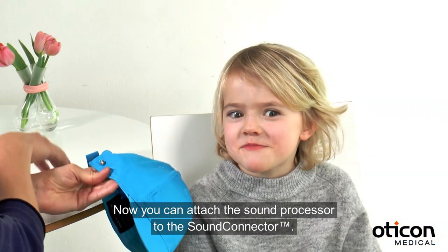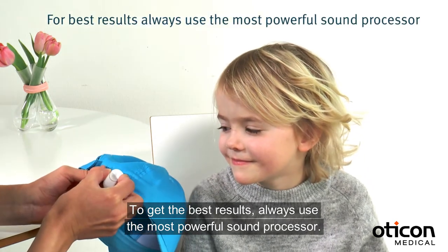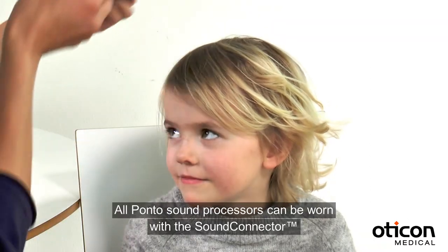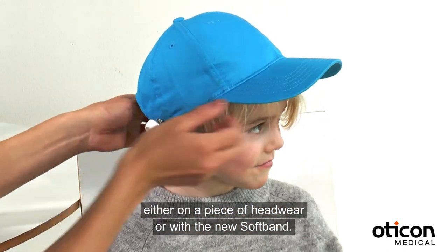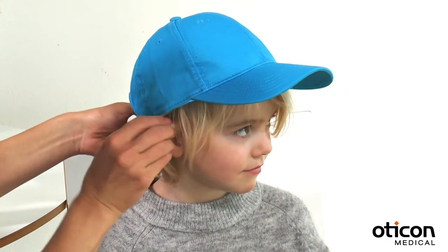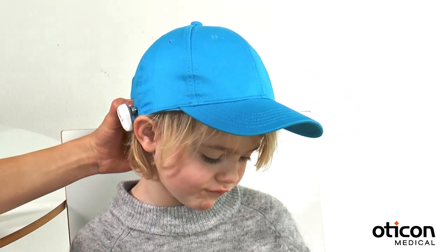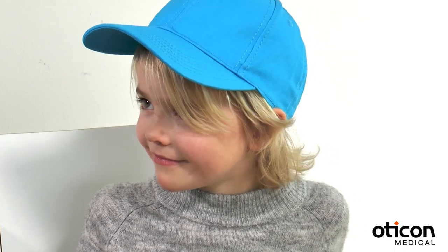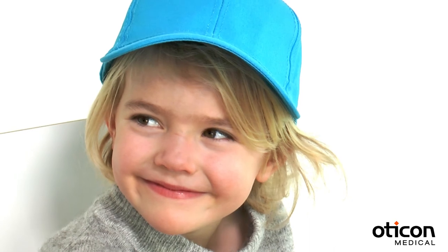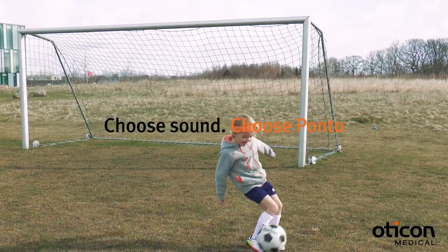Now you can attach the sound processor to the sound connector. To get the best results, always use the most powerful sound processor. All Ponto sound processors can be worn with the sound connector, either on a piece of headwear or with the new SoftBand.